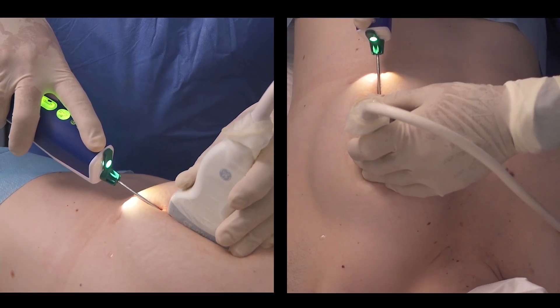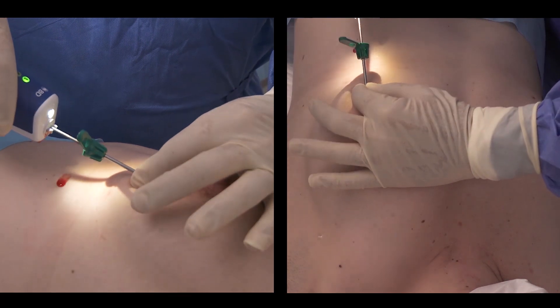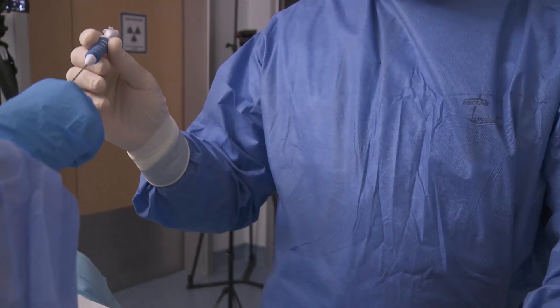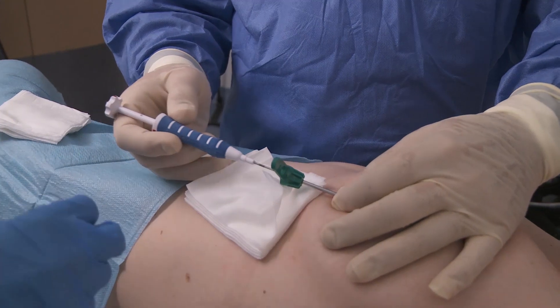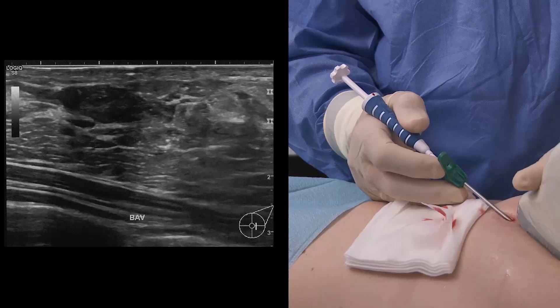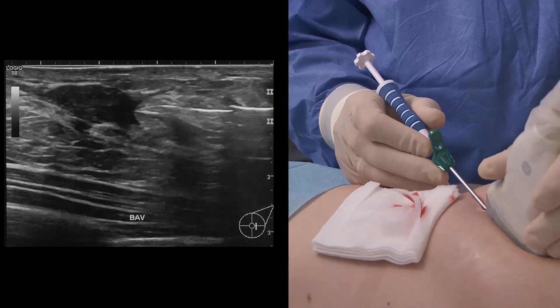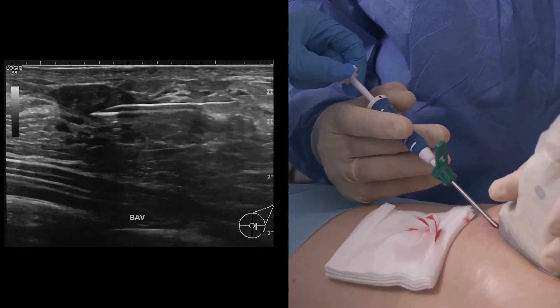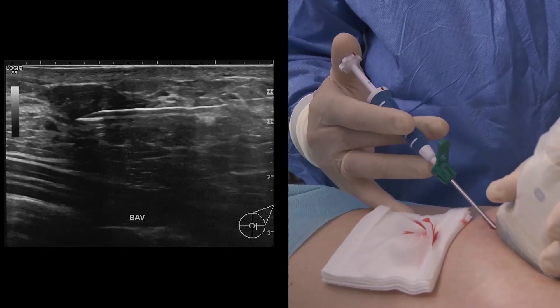To deploy the tissue marker, push the coaxial arm and twist the coaxial hub to detach the probe from the coaxial cannula, then remove the probe while keeping the coaxial cannula in place. Introduce the tissue marker applicator through the coaxial cannula. Follow the applicator bevel tip, and when in place, unlock the applicator. Make sure the two red indicators are aligned and push the plunger firmly all the way to deploy the tissue marker under ultrasound guidance.